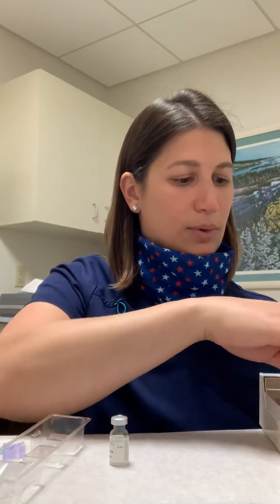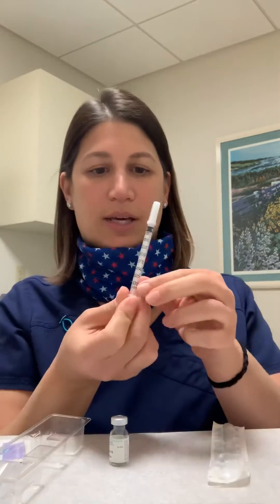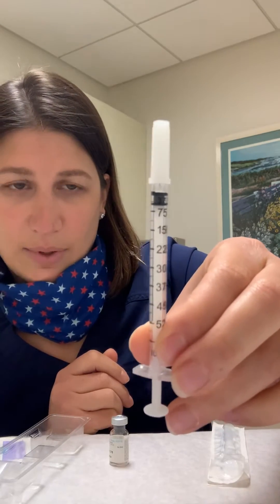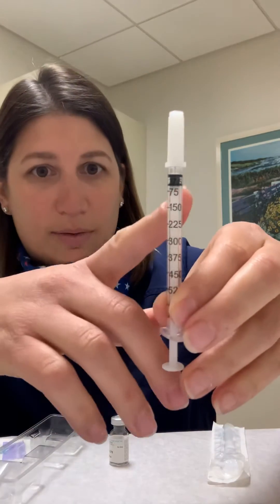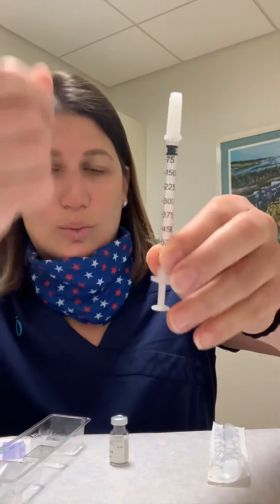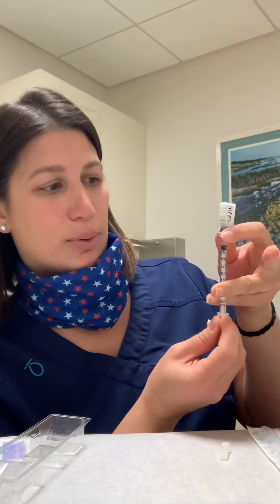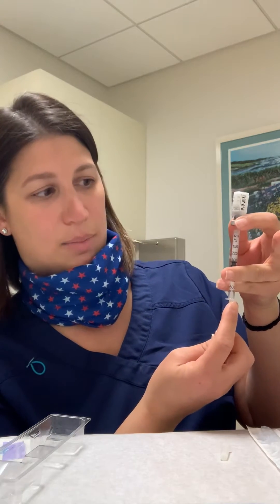In the kit, there will also be these extra syringes. These syringes actually have doses on them, so whatever your dose is — if it's 150, if it's 300 — you will pull back to that. You're going to take this, take that little cap off, put this right into the vial, turn it upside down, and then whatever your dose is, you're going to pull the plunger past that number.